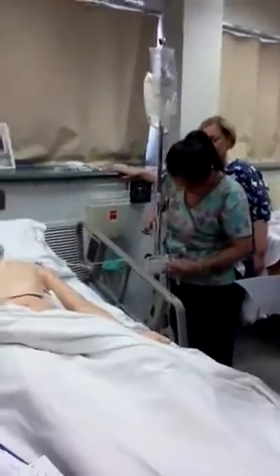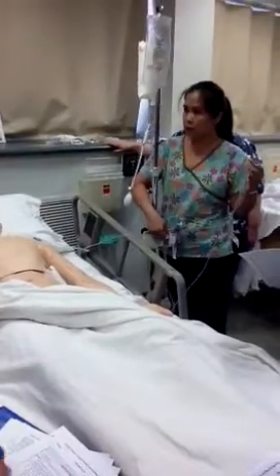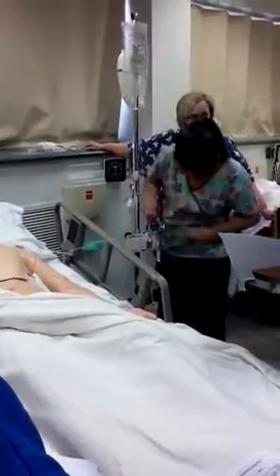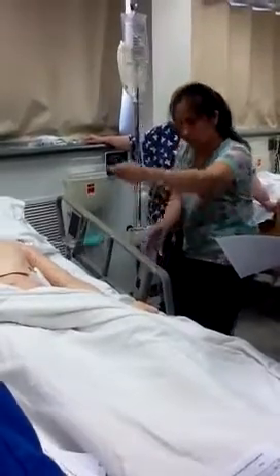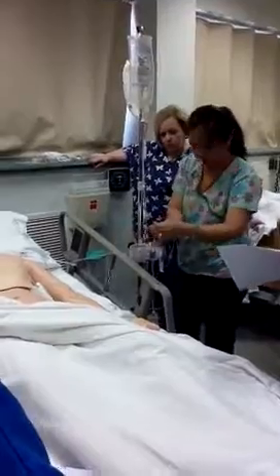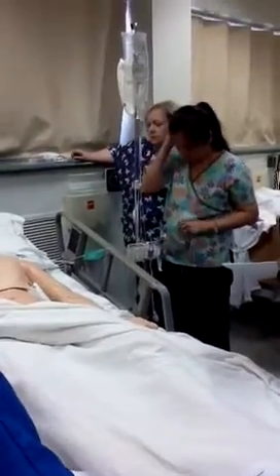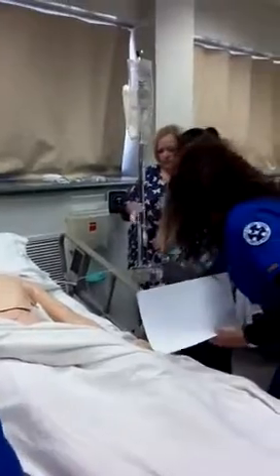There you go, this is the patient. So when you turn it off to the patient, always go this way. Sometimes you have a lot of tubes, so make sure you know where that is. Other people actually have a different setup than this. Yeah, it's usually this, so it's not usually that.